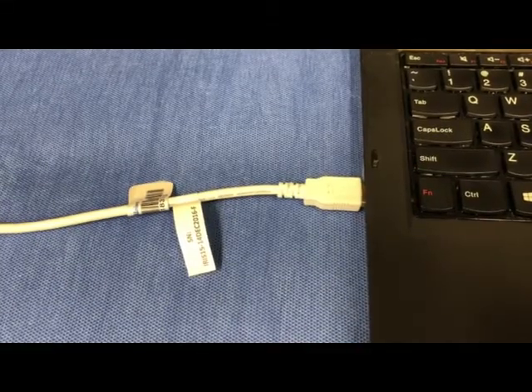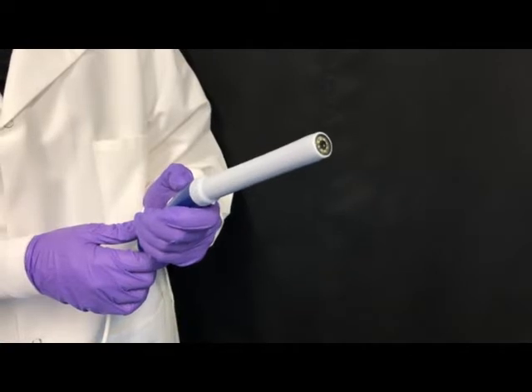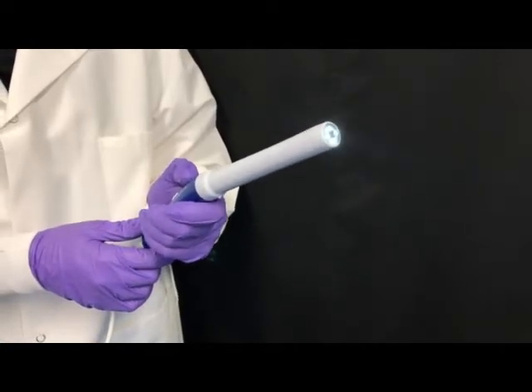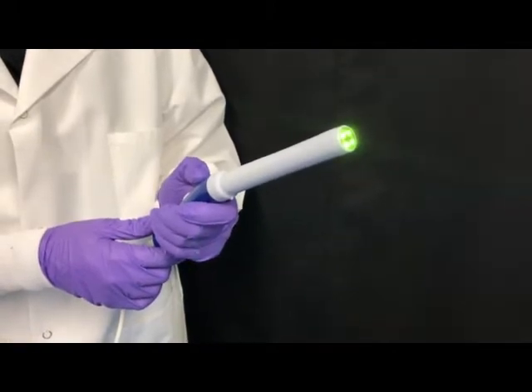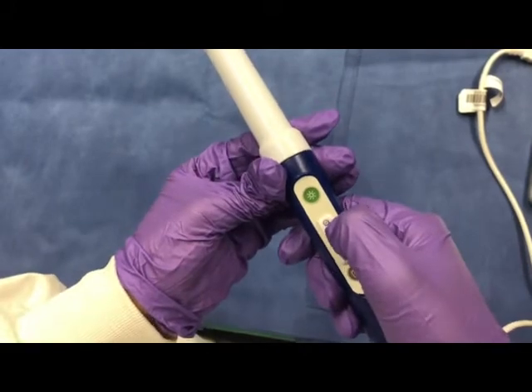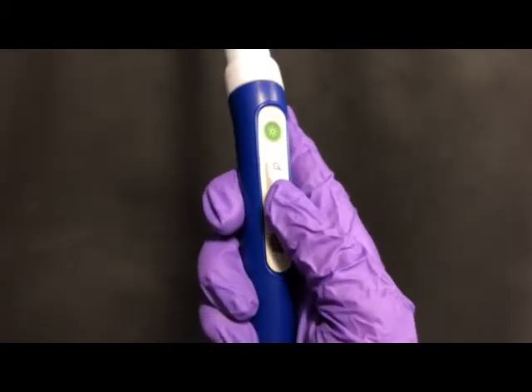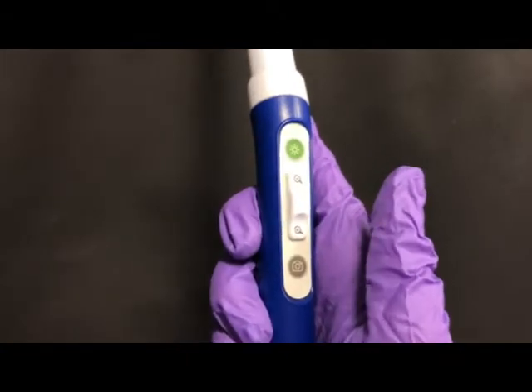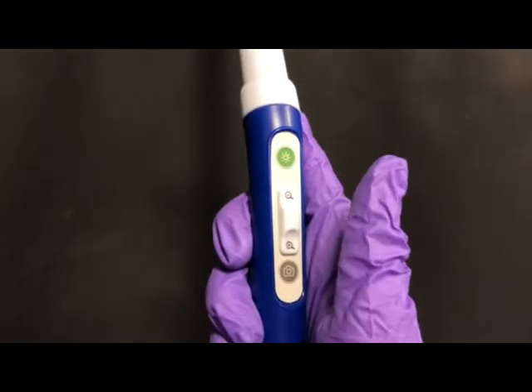If the pocket colposcope is disconnected from the power source during use, the light will turn off, and after plugging the USB back in, the light setting must be readjusted using the light toggle button. By sliding the magnification slider backwards away from the patient, the image can be zoomed in. Adjustments to the zoom setting should be done gently and will also require an adjustment to the position of the pocket colposcope itself to regain proper focus.